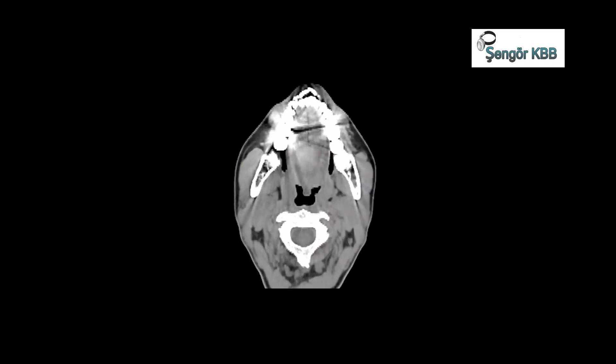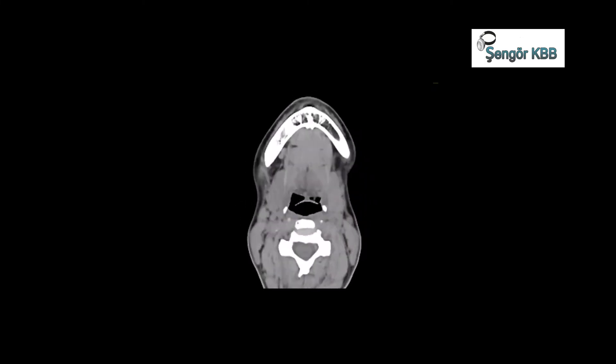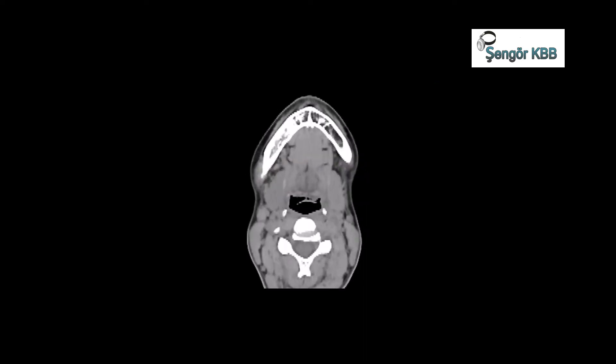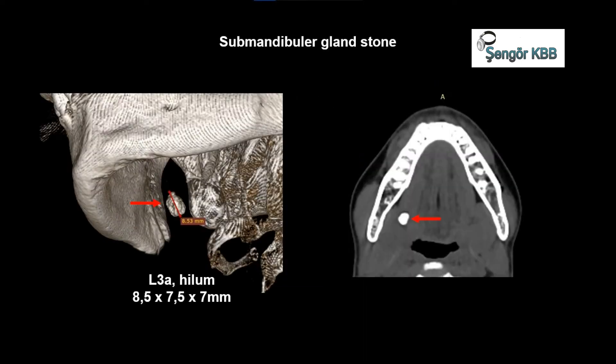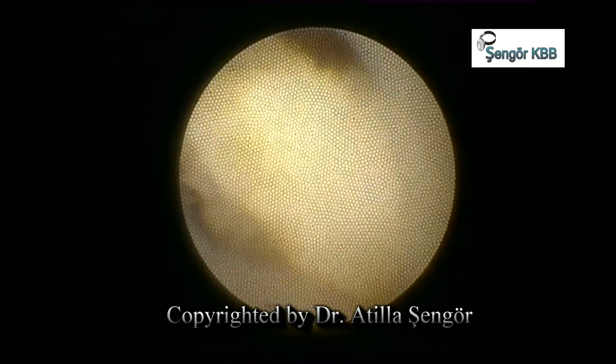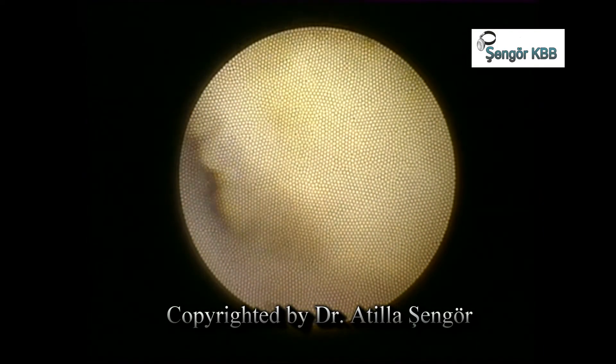Let's look at her tomography. You can see the stone in white color, medially to the right jaw bone. This is the 3D tomography image. It's obvious how deep the stone is located in the hilum. And this is the operation video. The stone was stuck 6 cm deep from the ductal orifice.